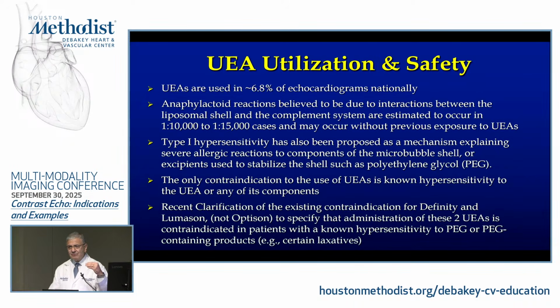Is the champions within an echocardiography laboratory, because yes, you will be paid for the cost of the agent, but importantly, you could see how impactful it is. It really is very impactful from a diagnosis point of view, and from a patient outcome and changing management point of view.